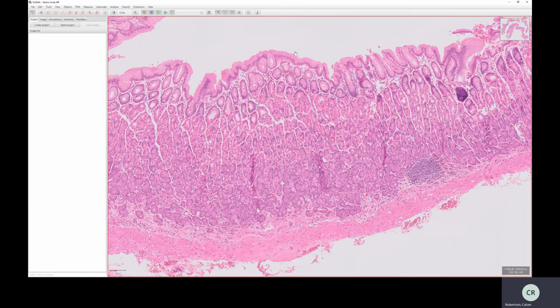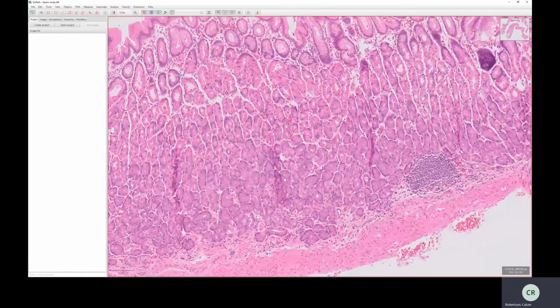The foveolar surface is not specific to the gastric body, but if you see these parietal and chief cells, you know you're in the gastric body or in the fundus, which has a similar look. So body or fundus. There will be some neuroendocrine cells among all this too, but I can't really identify them on H&E here. This here is a lymphoid aggregate.